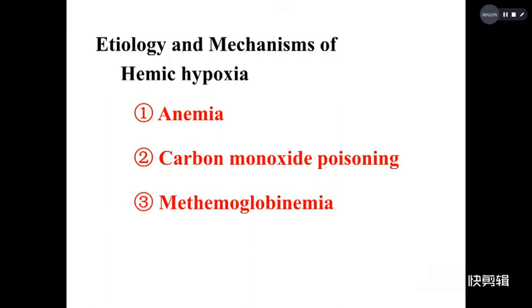Oxyhemoglobin liberates oxygen with difficulty, so oxygen moving into the tissue cell decreases and hypoxia happens. Now today we will do carbon monoxide poisoning and sodium nitrite poisoning.